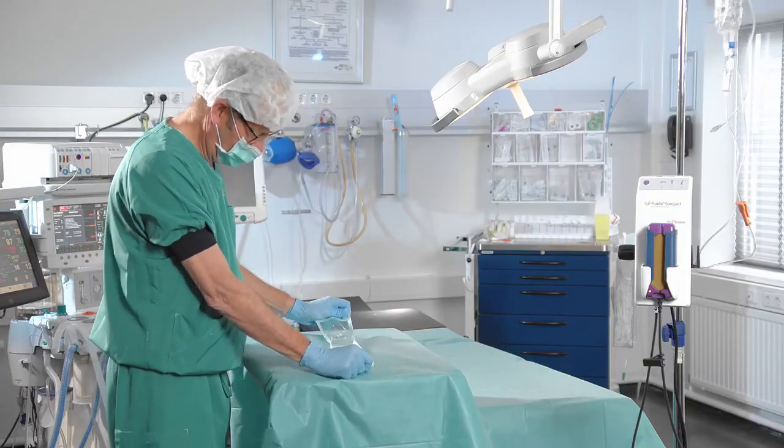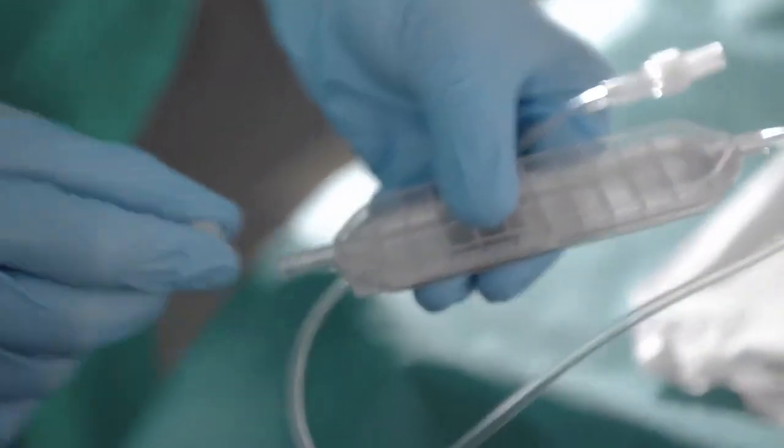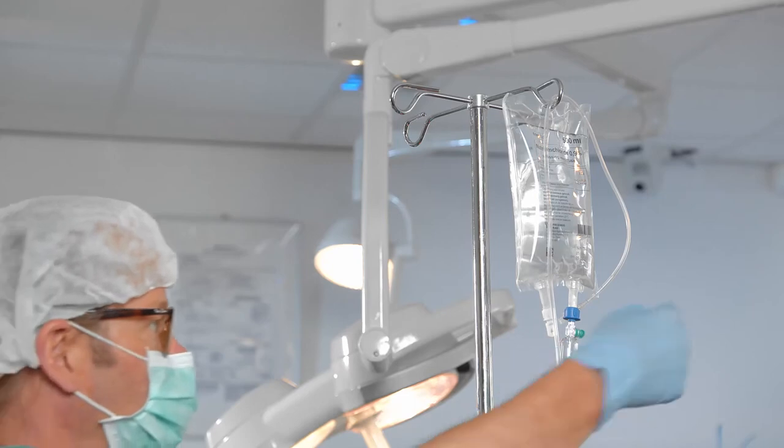Unpack the disposable set. Connect the hospital administration set to the cassette of the disposable set.